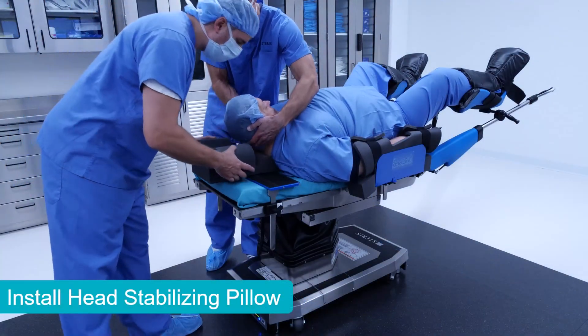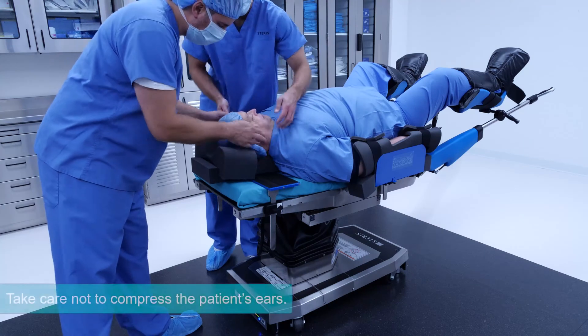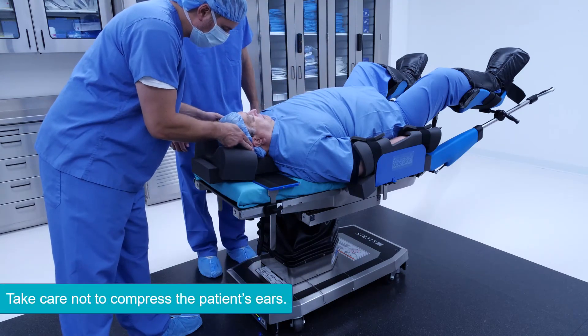The head stabilizing pillow secures the head and keeps it from rocking. Take care not to make contact with the patient's ears.